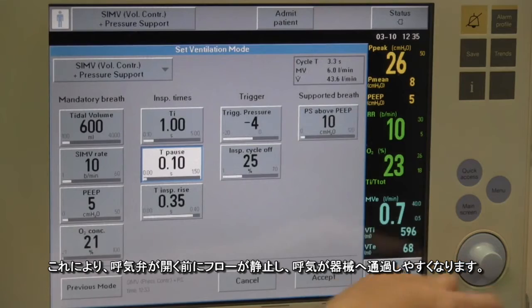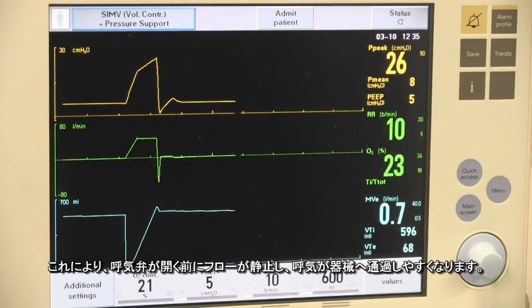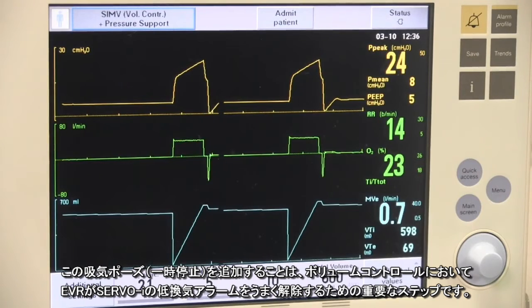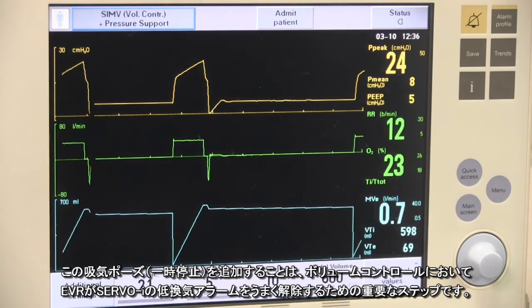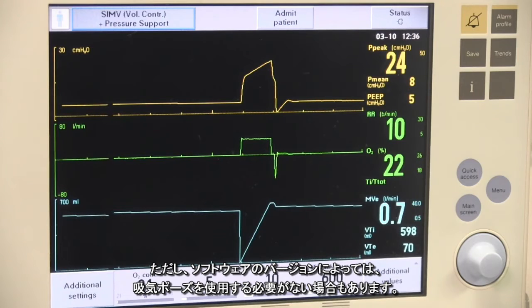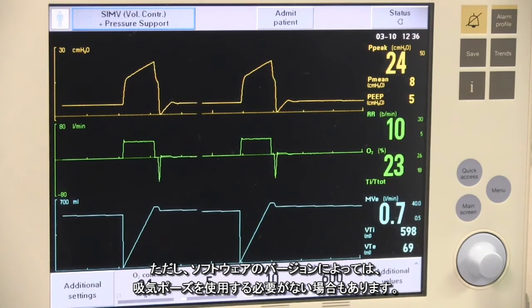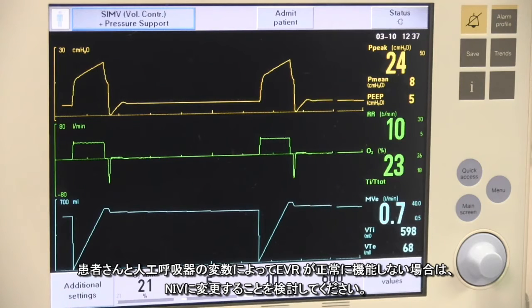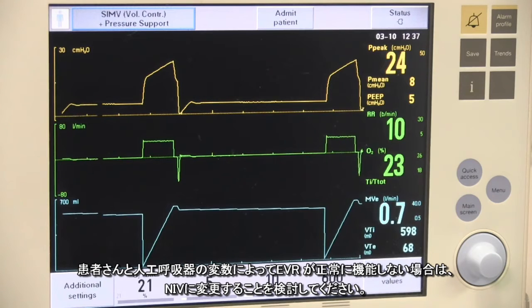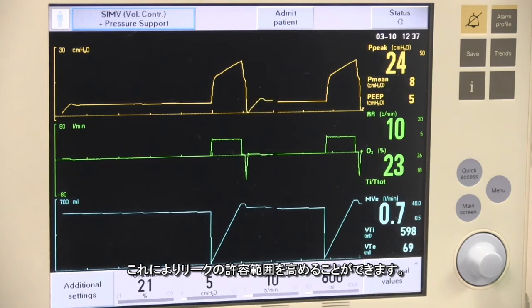This gives the ventilator circuit a brief moment to stabilize without flow prior to the exhalation valve opening to allow for expired air to pass. We have found that adding this inspiratory pause may be an important step to ensure that the EVR successfully eliminates low exhaled volume alarms with the Servo-i when in volume control ventilation. However, again, with certain software versions, it may not be necessary to use the inspiratory pause. If patient and ventilator variables prevent the EVR from successfully eliminating the low volume alarms, consider changing the patient into non-invasive ventilation, which allows for greater leak tolerance in regards to alarms.